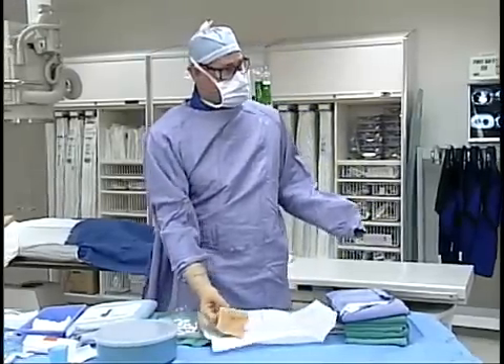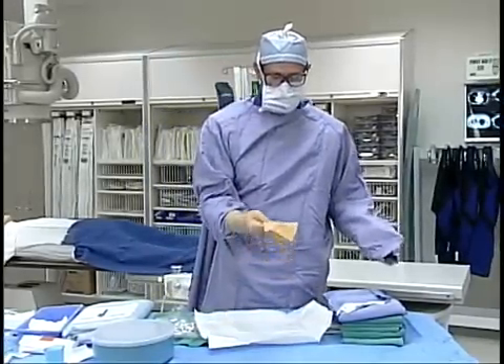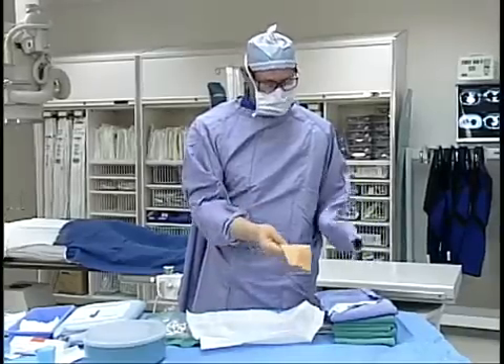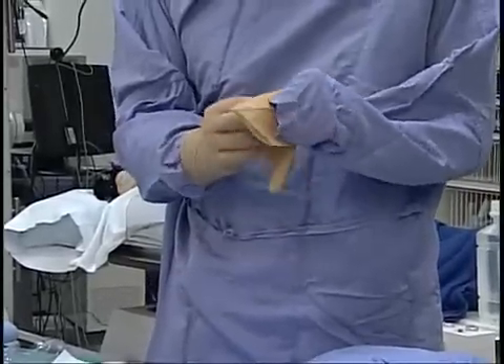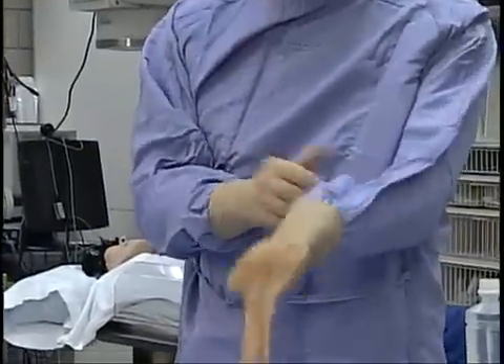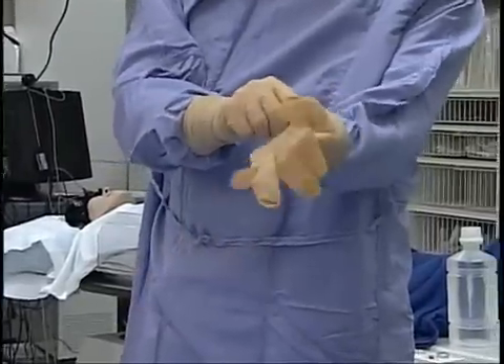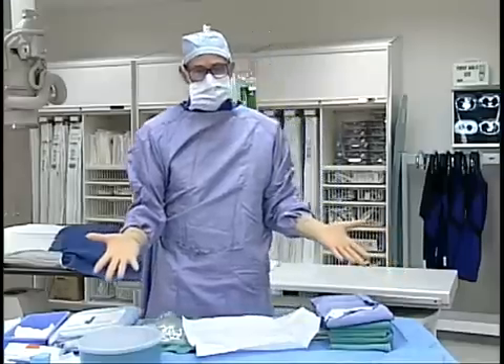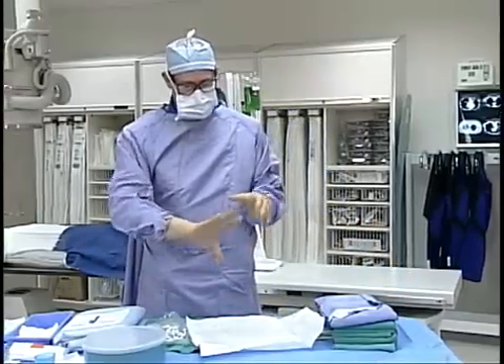Next, repeat the process for the other hand, picking the glove up now with the sterile gloved hand. Thumb underneath the cuff at the point of the other thumb, flipping the glove over, then gown and glove together — pulling the hand through until both hands are inside the gloves completely.